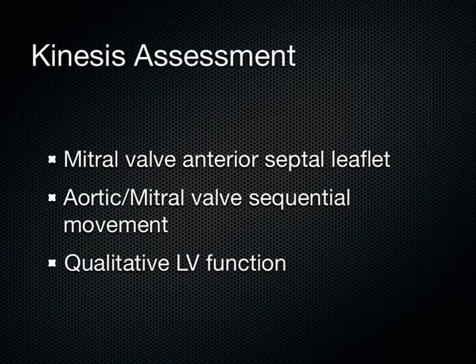We're going to finish this lecture off with kinesis. Okay? Kinesis. I've got a patient who's hypotensive. Do I give them fluids or pressors? That's kind of like my first branch point in my head when I've got a patient with hypotension. And I can help that branch point one way or the other using this kinesis assessment.